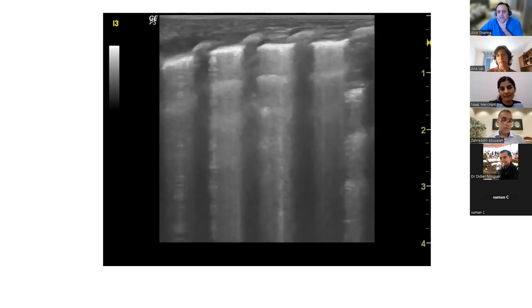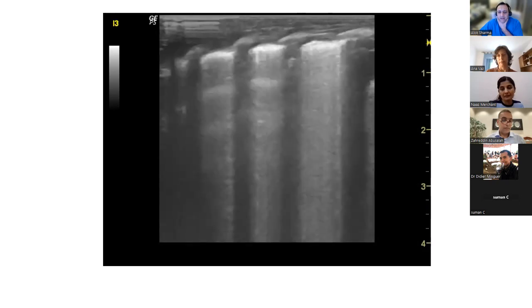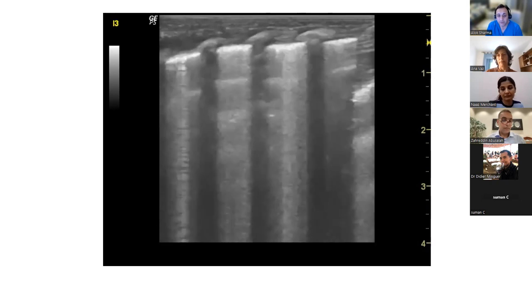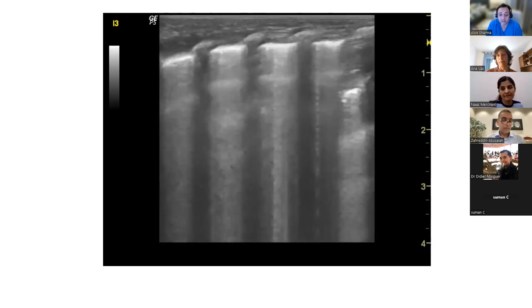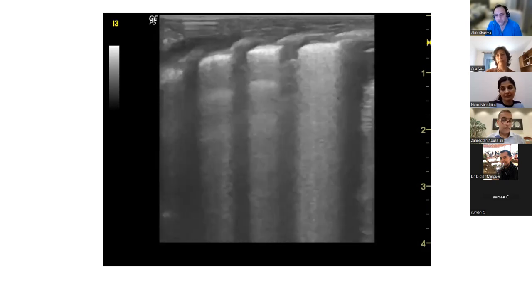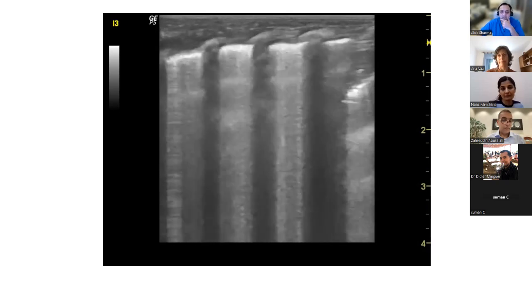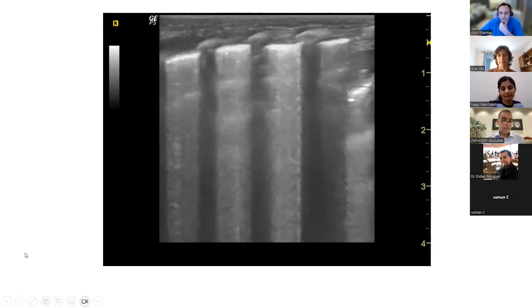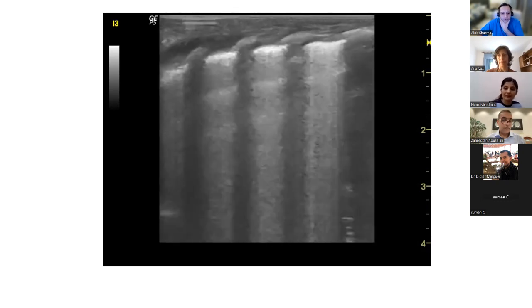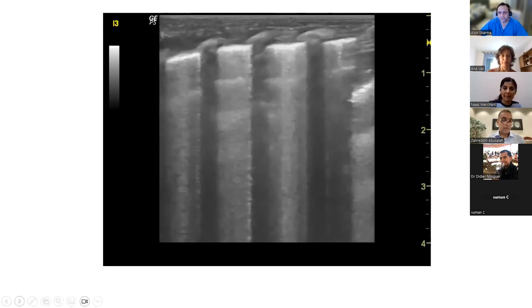But the step ahead is, for some of us, we've achieved a really good level of image quality. And again, with some of the sessions that we're doing at the moment, you're going to see the step up in image quality. I'm just going to show you some of the images that I've taken a few years back and try to get you to image optimize. But here, Anna, you've got some very good images. There's nothing I can suggest. For me, the fact that you've got a uniform appearance right down to 4 centimeters, and you're describing the artifact right up to that point, it's amazing. My congratulations.